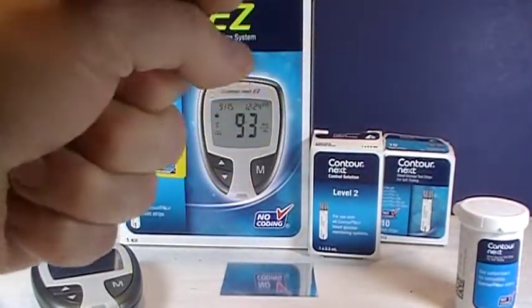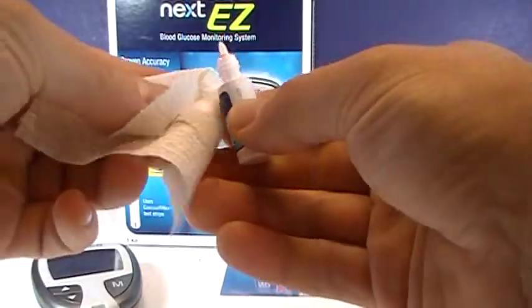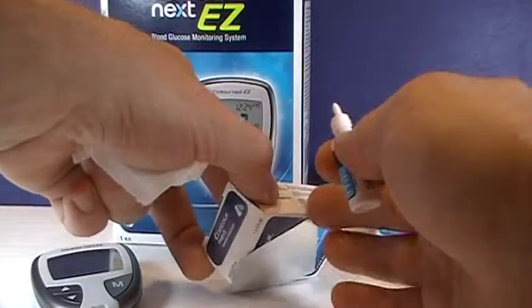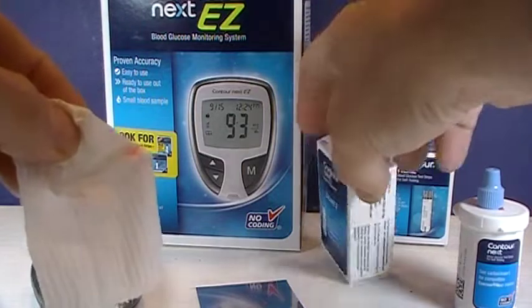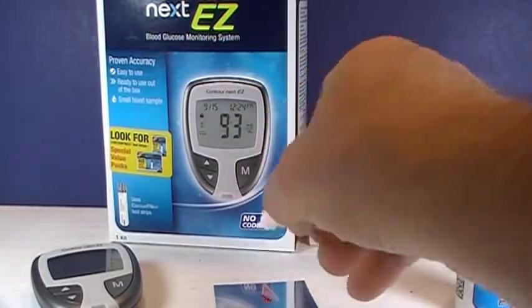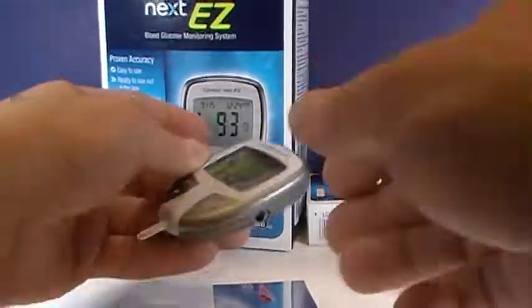Open the control solution. The manufacturer recommends wiping away any control solution that may be on the tip with a clean tissue. Put a drop on your non-porous surface. Then put the strip in there until it beeps.